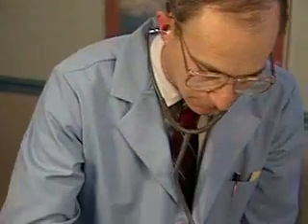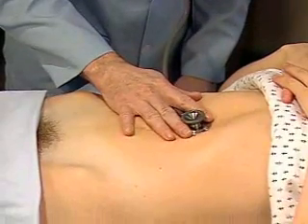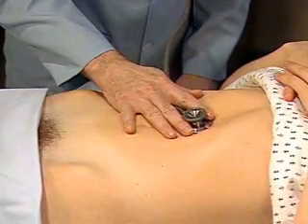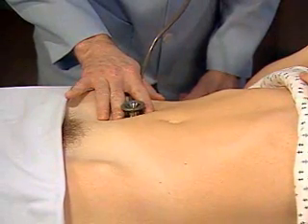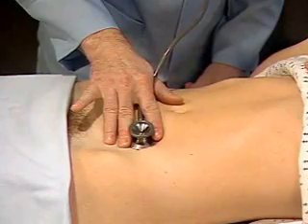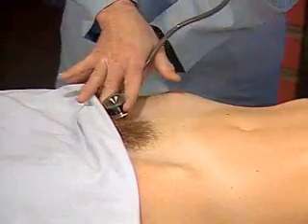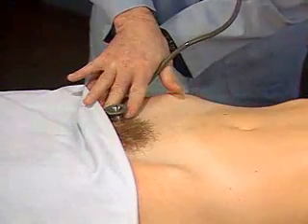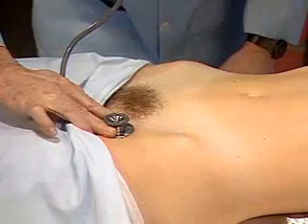If you suspect arterial insufficiency in the legs, listen for bruits over the aorta, right iliac artery, and left iliac artery. Then identify and listen over the right femoral artery and left femoral artery.